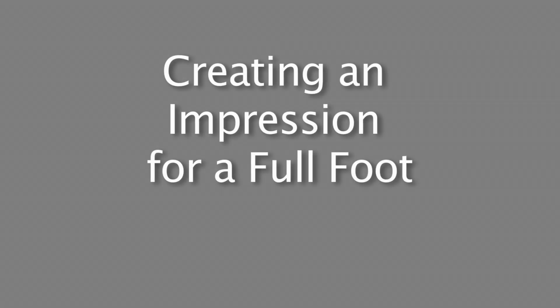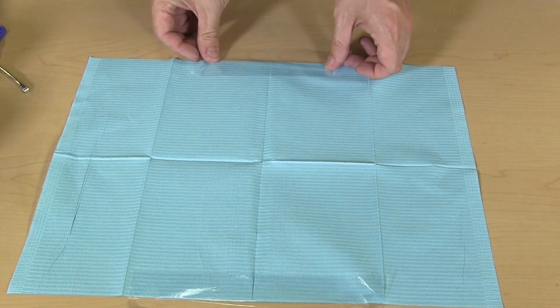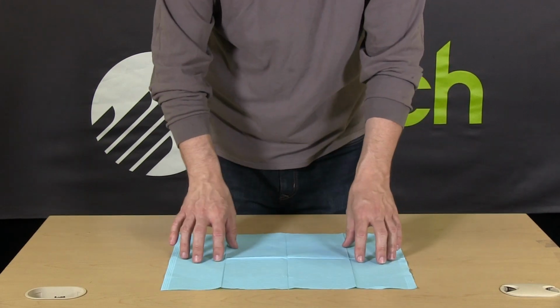In this tutorial, we will learn how to take customer impressions with proper technique. On a clean, flat surface, tape down the work mat. For foot impressions, this should be done on the floor. An unsecured work mat will make it difficult to use impression material later on.